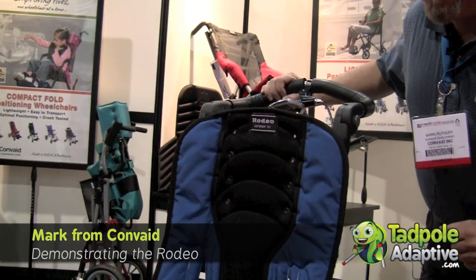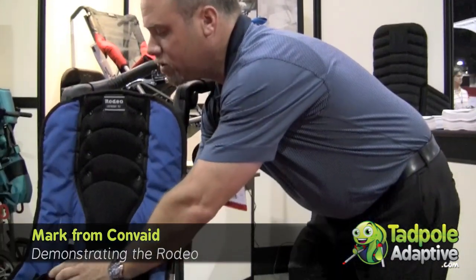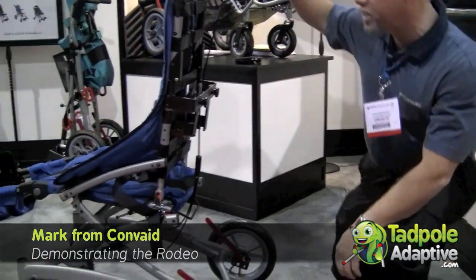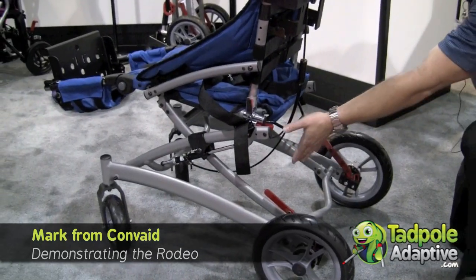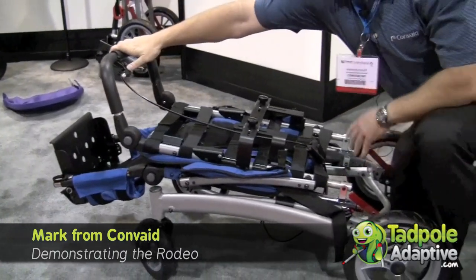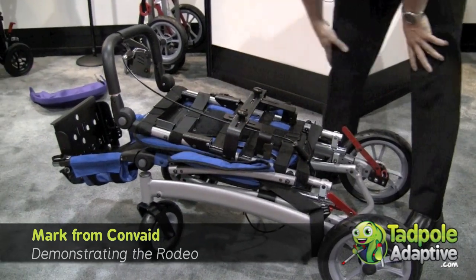The Rodeo is also a foldable chair. One option available that I'm not showing on this Rodeo is flip-up armrests. To fold the Rodeo, normally I would flip up the armrests and fold in the firm laterals. Then on the back, I have two buttons to engage simultaneously — this red button and this black folding bar. By doing both simultaneously, the Rodeo folds right over nicely and compactly, and with a closure strap you can secure it closed.